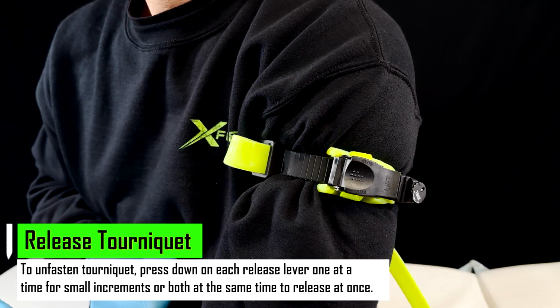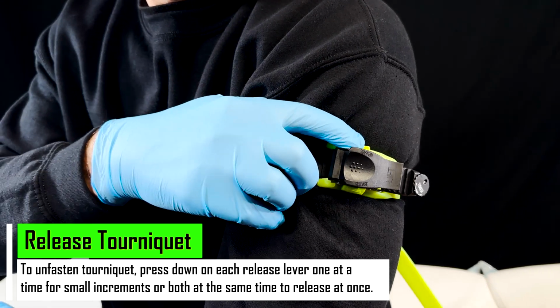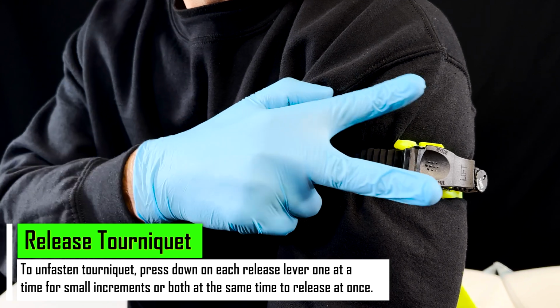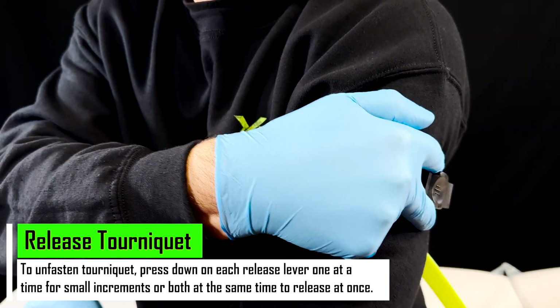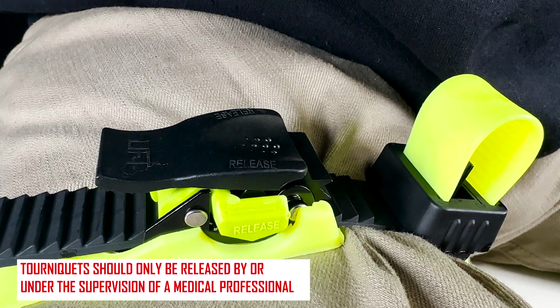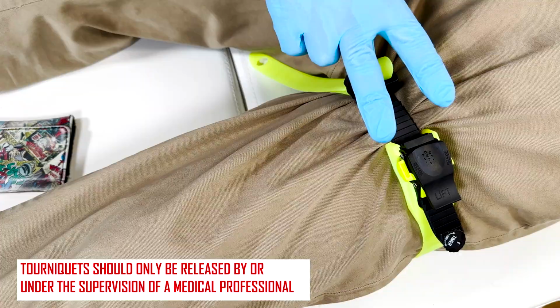Release tourniquet. To unfasten the tourniquet, press down on each release lever one at a time for small increments, or both at the same time to release at once. Tourniquet should only be released by or under the supervision of a medical professional.